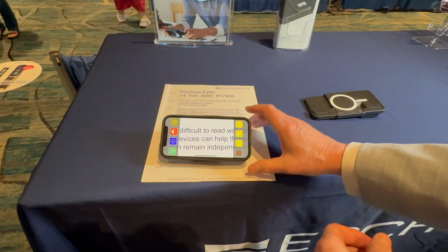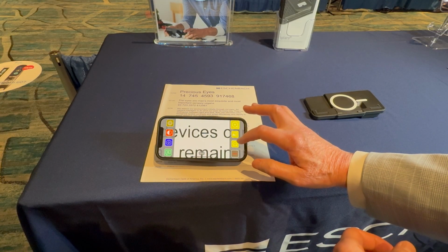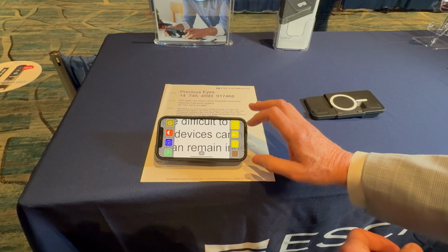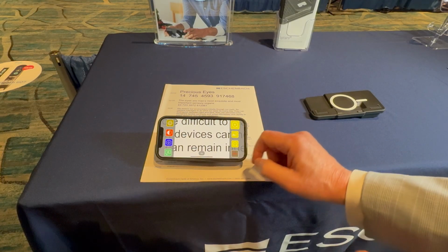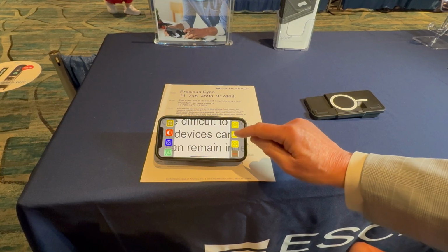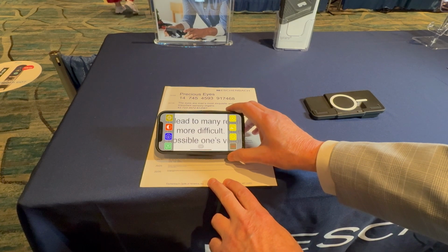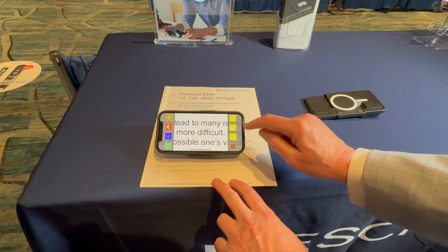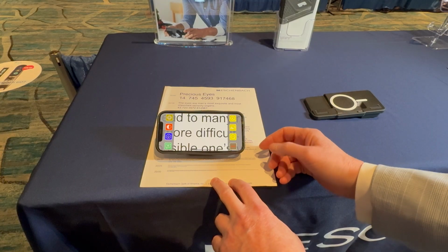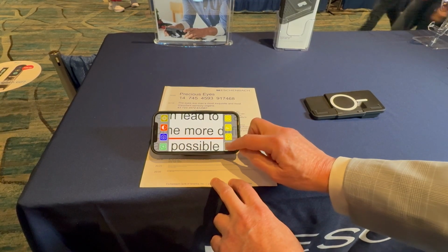And so there's different icons on the side. The top one does magnification increase, and the one two times below that is the minus. The one in between is an overview button. So if I'm at 5x magnification and I want to zoom out and go to another part of the page, I can hit the overview button. It goes down to the lowest magnification of 3x, and then when I go back to the text I want to see, I hit that middle button again and it goes back up to 5x, so it remembers where I was. The bottom icon offers an underline feature to help for orientation.